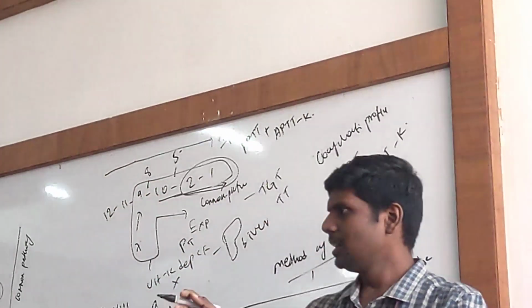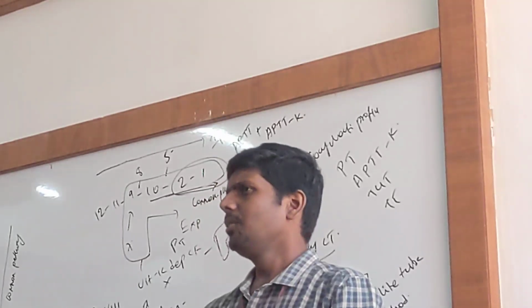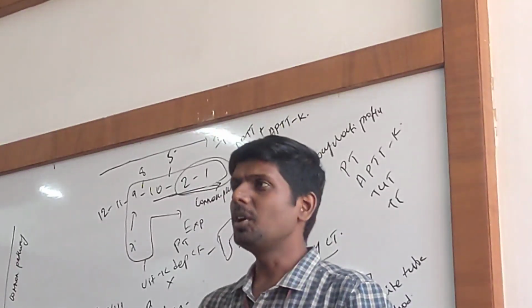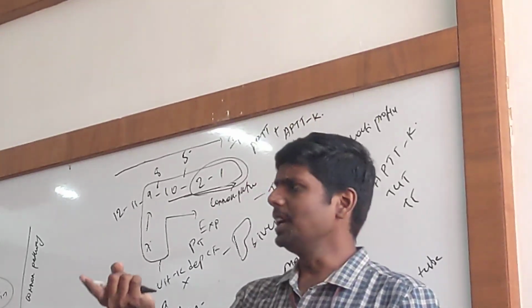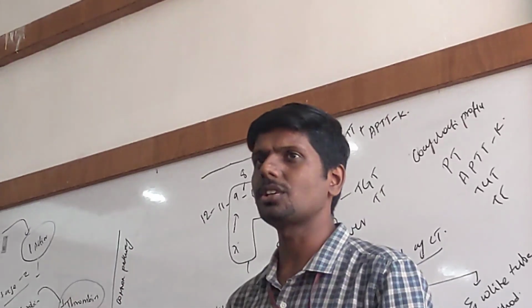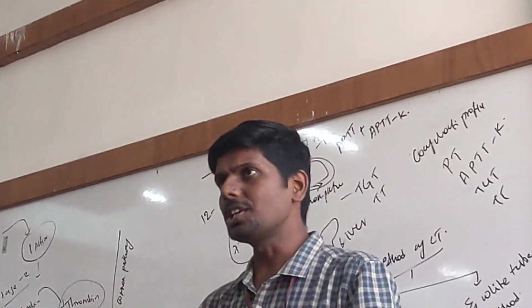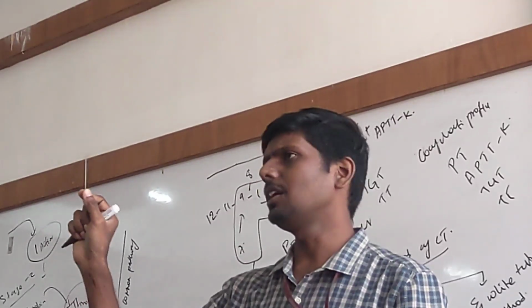Let us imagine this is summer and the outside temperature is around 44. What might be the clotting time in a warm temperature? It might increase, right? Because the blood became more thin or the proteins might denature. Then what might be the clotting time in a chilled room? Maybe it is 16 degrees. The clotting time will decrease. Maybe in 1 minute the blood might clot. So temperature will affect the results. Am I correct? Temperature might alter the results.